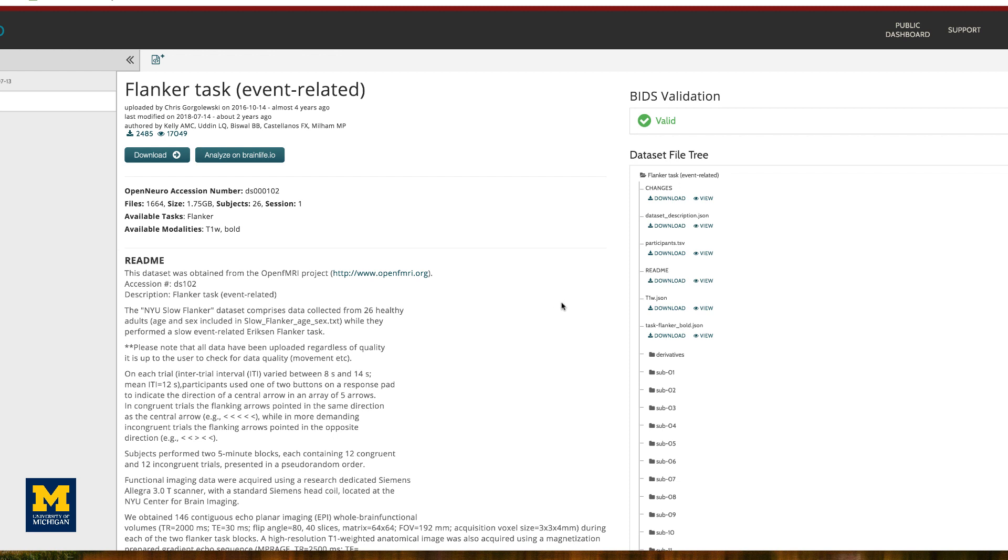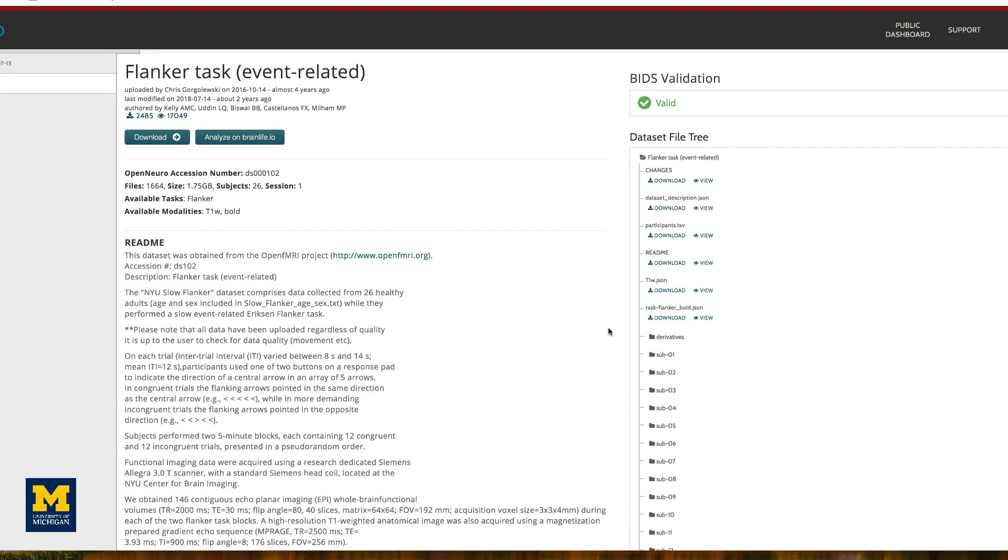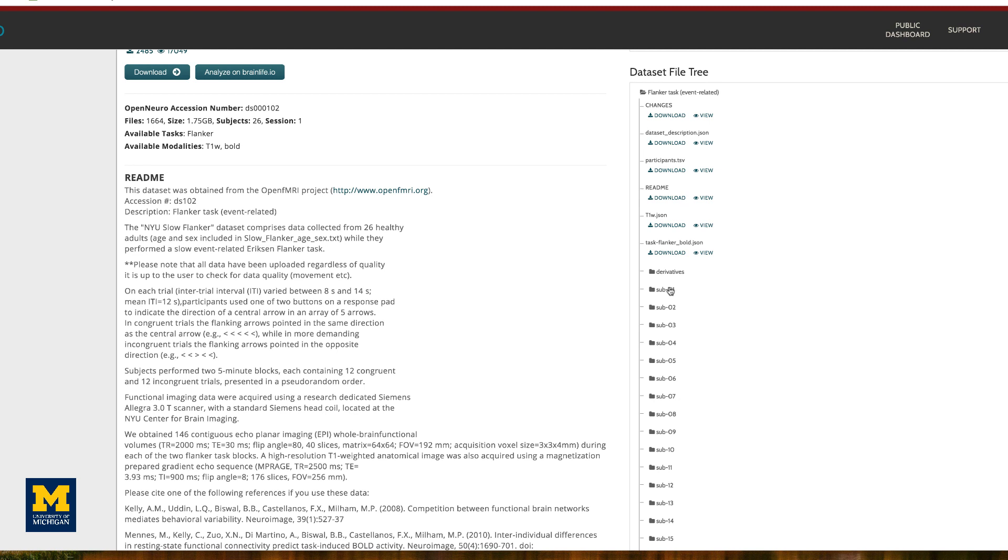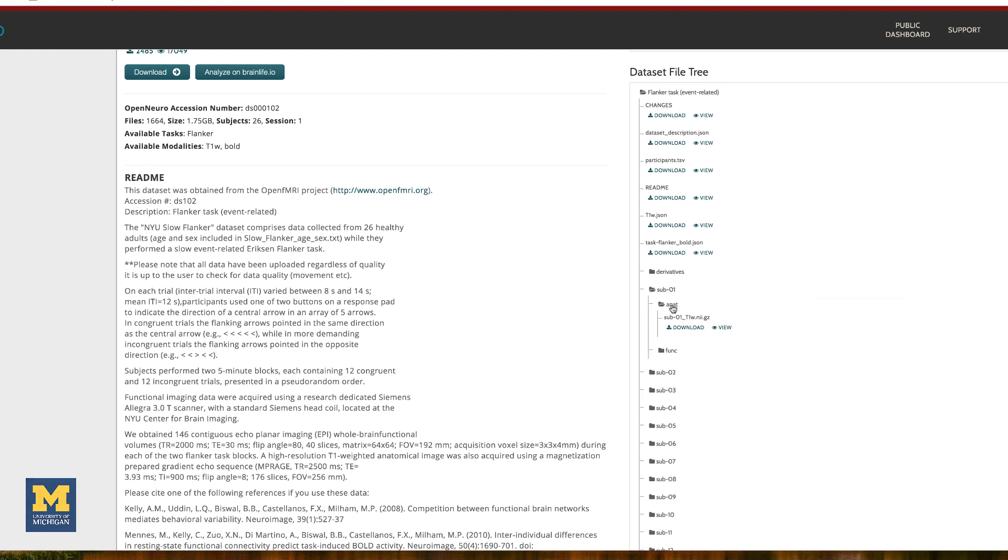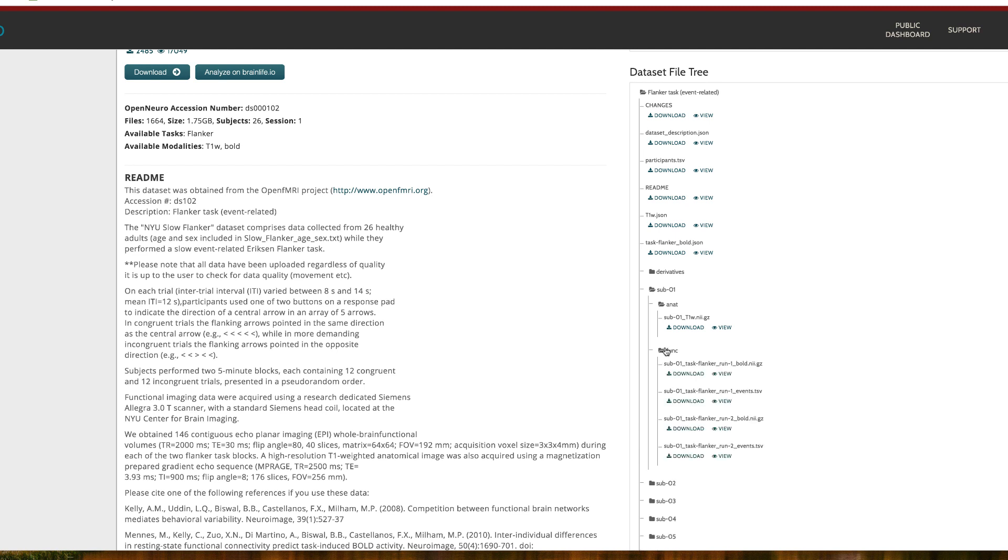The OpenNeuro page for the Flanker data set includes a data set file tree, which includes the folders ANAT, which contains the anatomical image, and FUNC, which contains the functional images and onset times for each run in a TSV file.